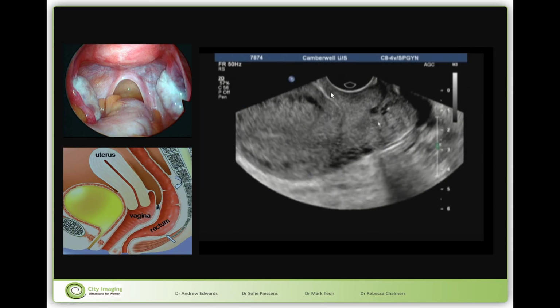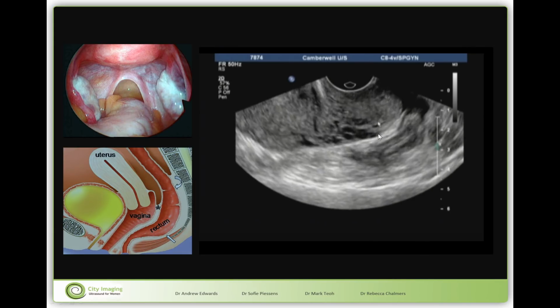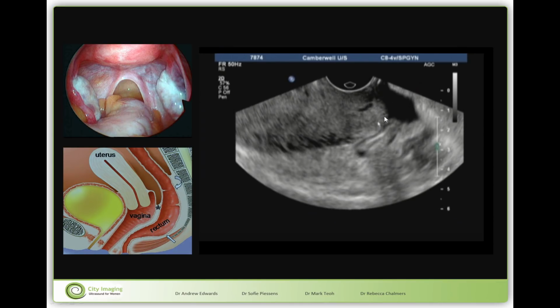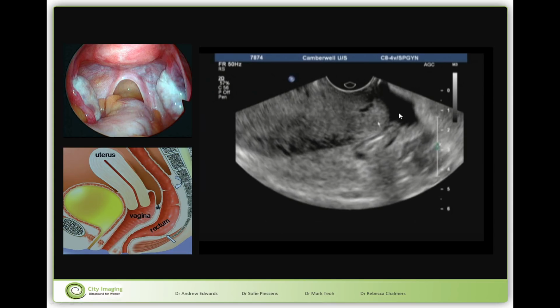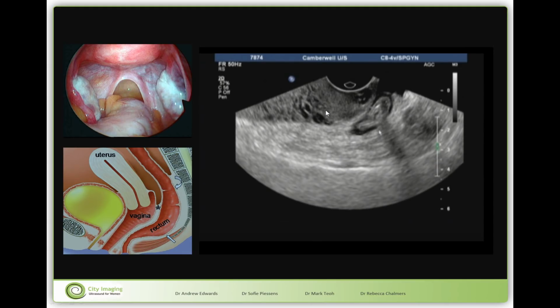So when we look here at this clip, we see the uterus slide very nicely over its entire length against the underlying bowel. And here, this is the peritoneal reflection I'm talking about. So this is actually this area here. The cervix is here. This here is the vaginal wall. And this is the peritoneal reflection in which we see a little bit of free fluid, which makes it much easier to outline the pouch of Douglas. But this is a beautiful example of a non-obliterated pouch of Douglas.